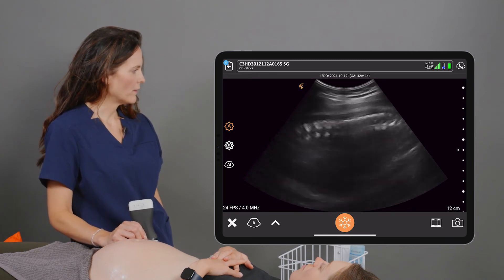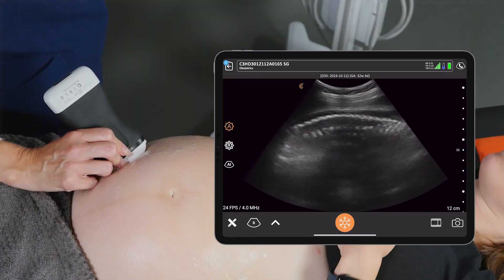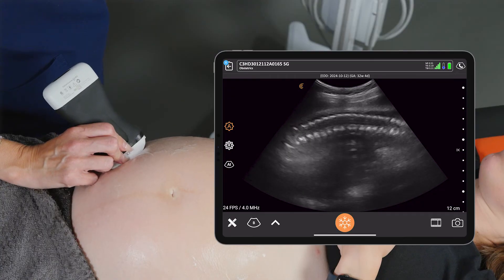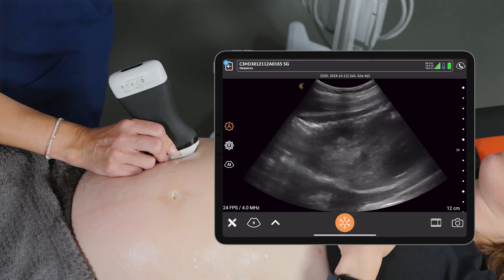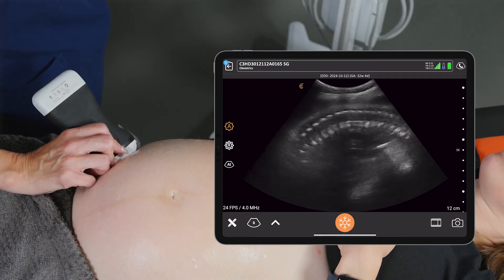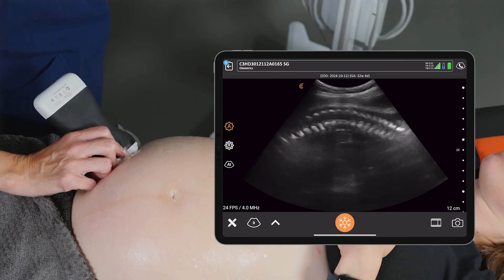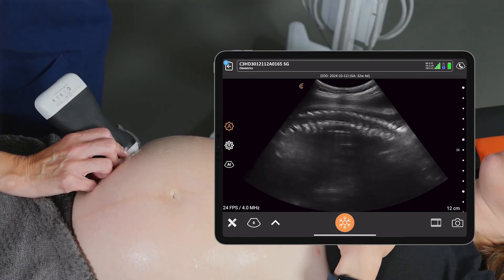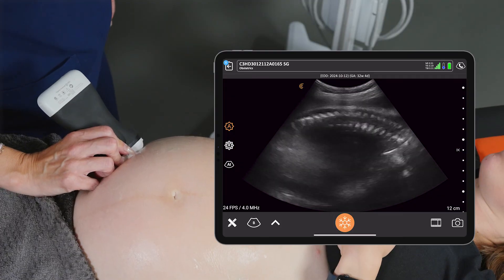We can also look at the baby's spine for fetal tone, as flexion and/or extension of the spine also counts. Here we can see a nice sagittal view of the baby's spine, all the way down to the lower portion. There is some flexion and extension movement of the baby's spine there, so I'm happy with that for the fetal tone portion.